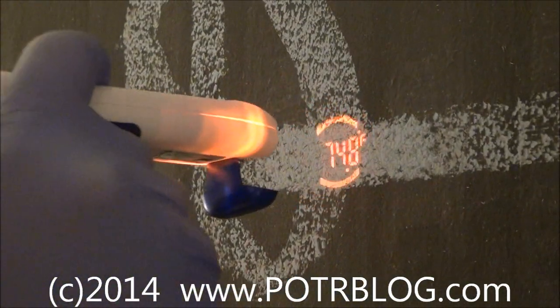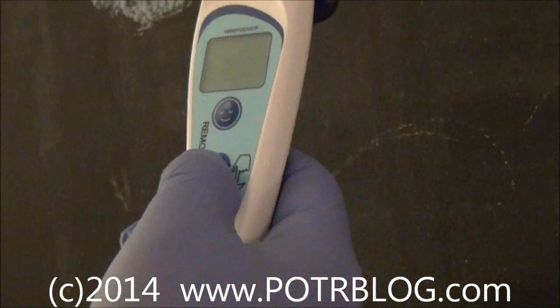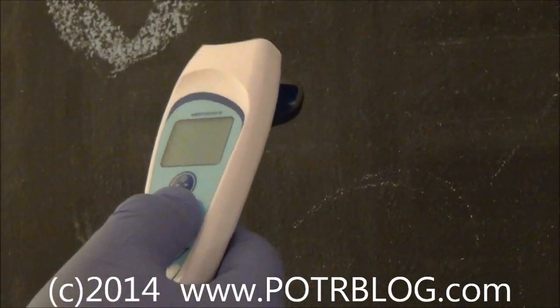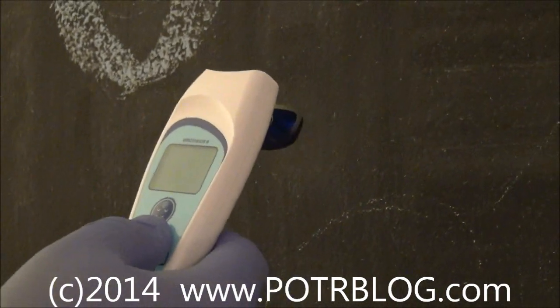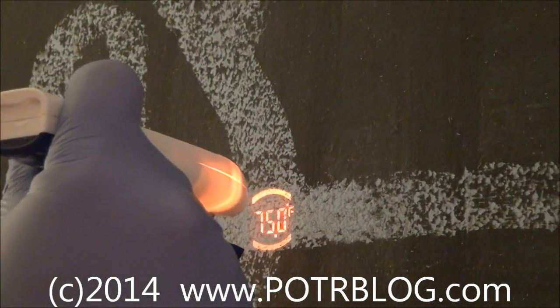Now you can instantly take thermal readings and go from person to person — that's what makes this a high-speed multi-person reader. Another drawback is you really can't take your own temperature with this unless you're looking in a mirror so you can make sure the line is focused directly on your head at the proper distance.